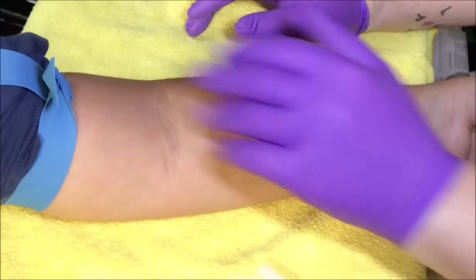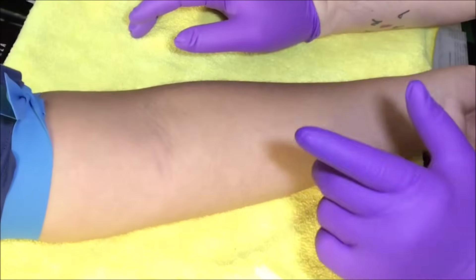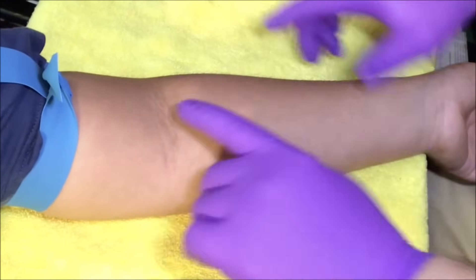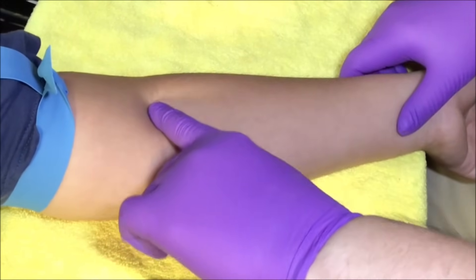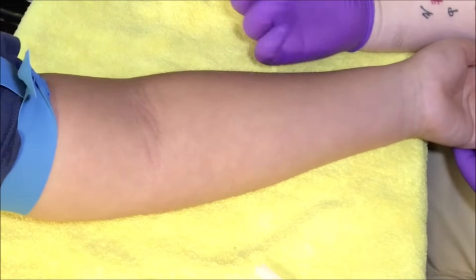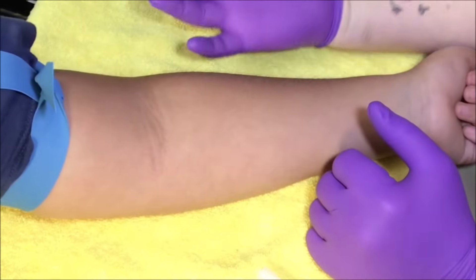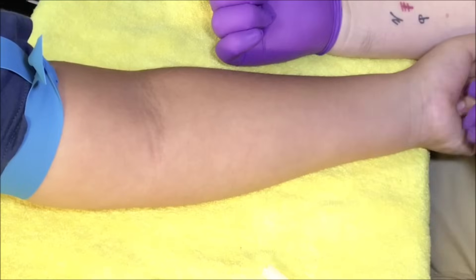After you're done finding which arm you want to use and assessing the arm, you want to put your tourniquet on and try to locate a vein first and foremost. Usually what you do is take your index finger and start to push down and locate a vein. I might have the person make a little fist — don't squeeze, just make a fist — and I don't want them pumping, because this can cause hemoconcentration and mess up the test.